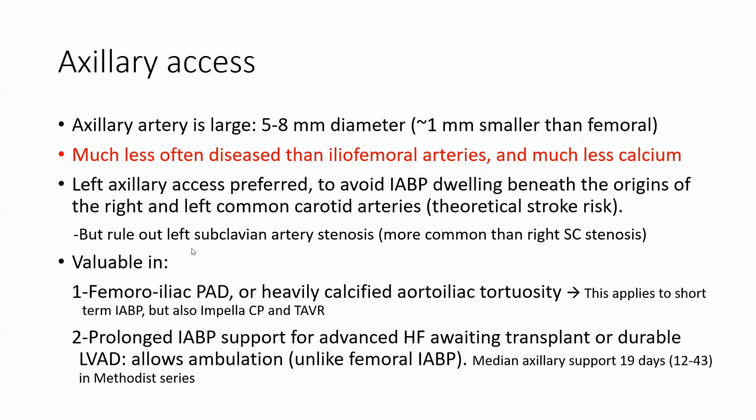Another idea here, there is one mostly surgical series that used the right axillary artery instead of the left, or more than the left, and it showed that that was safe as well. And I will describe some potential advantages of the right access in some instances.